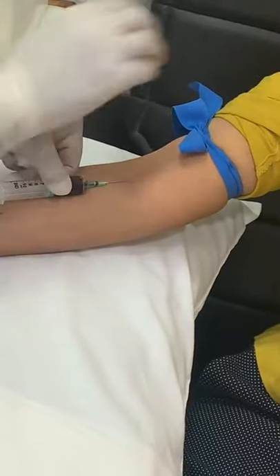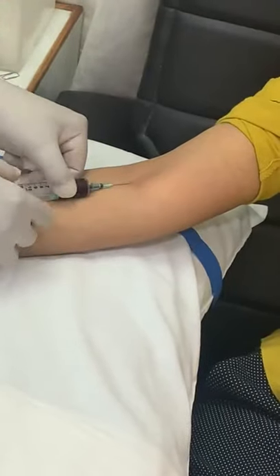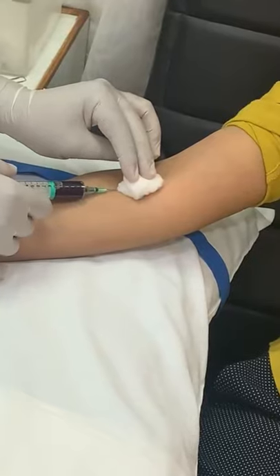The collection is successful. The tourniquet is to be removed. Now cotton is to be applied. Elbow to be folded.